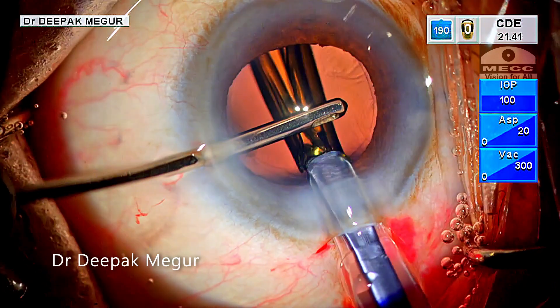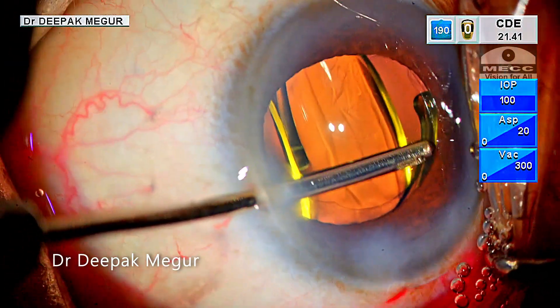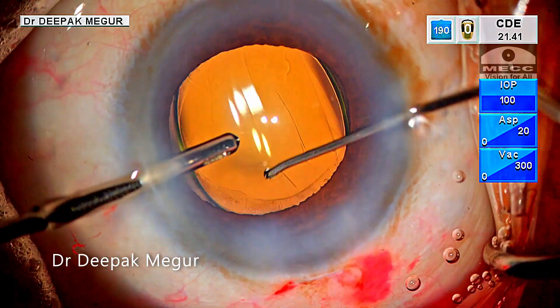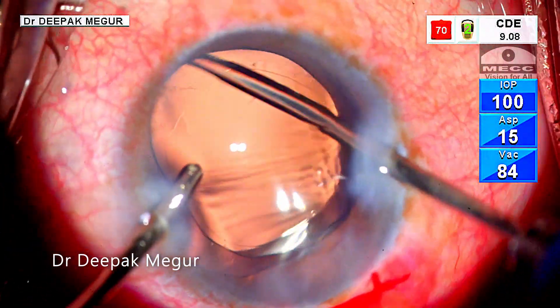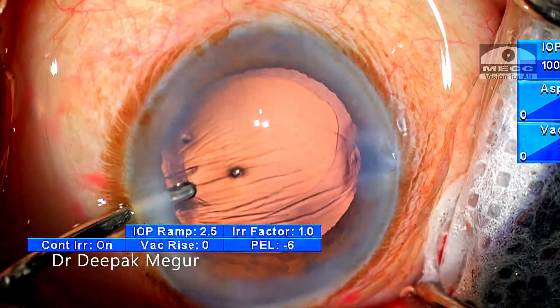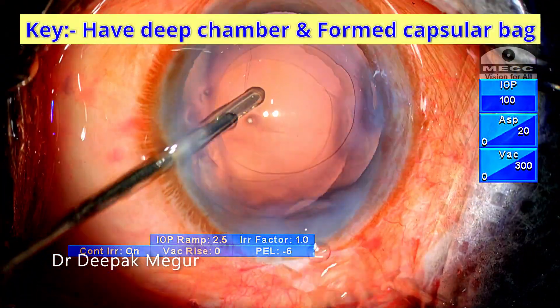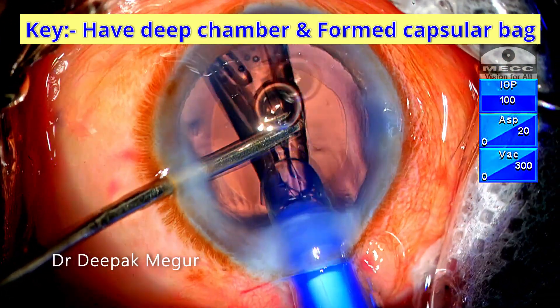Hydro implantation of lenses is a neat and effective technique for implanting a single piece intraocular lens, and most of us have been using this technique for many years. The main advantage is that the lens implantation process is quick since the OVD removal step is not required. The principle is that we use the inflowing BSS through the irrigating cannula instead of OVD to deepen the chamber and maintain the capsular bag. The key is to have a deep chamber and a well-formed capsular bag during IOL implantation.